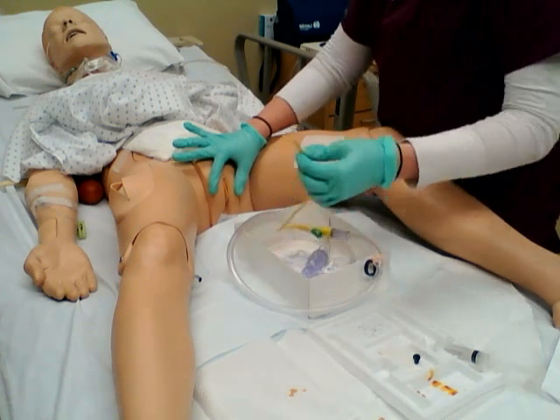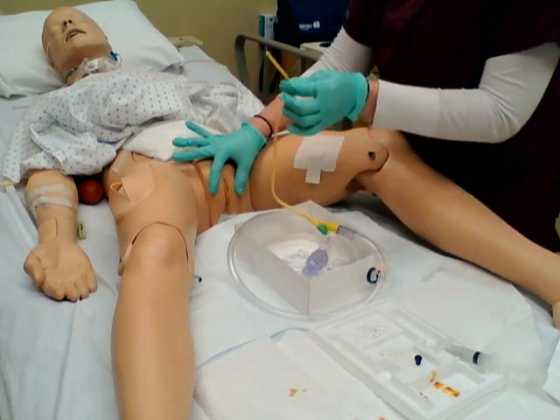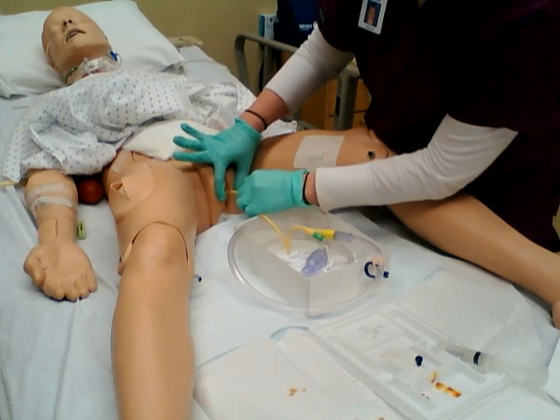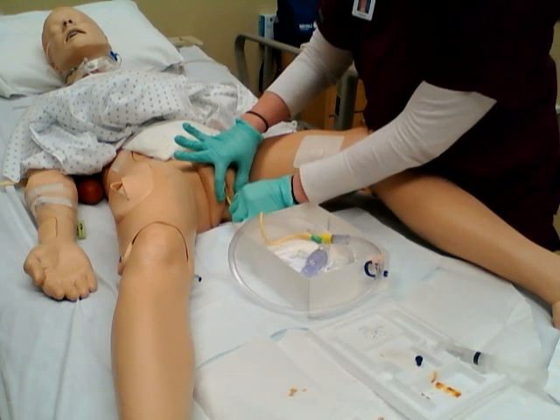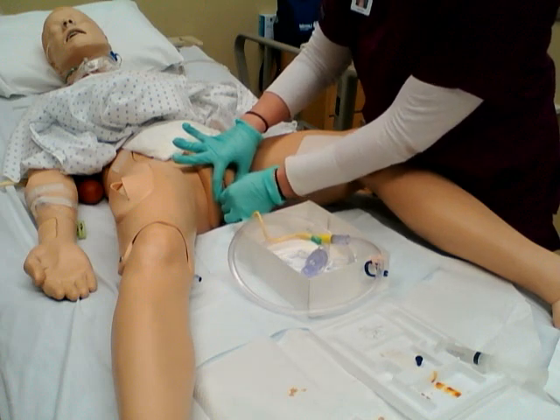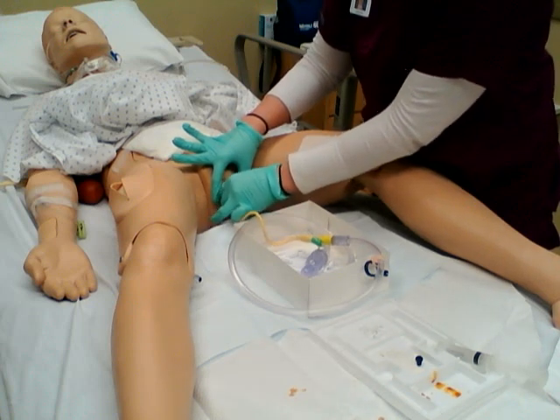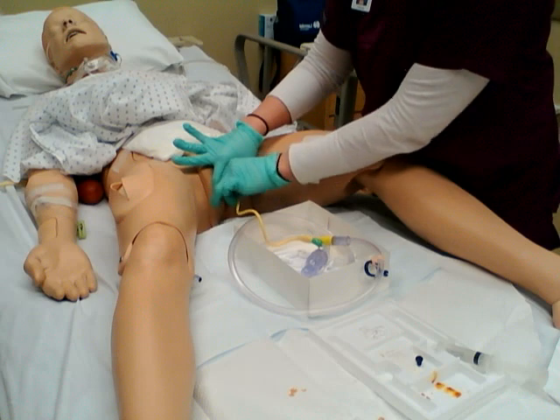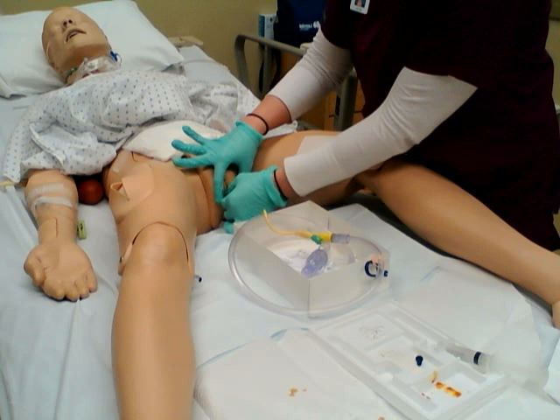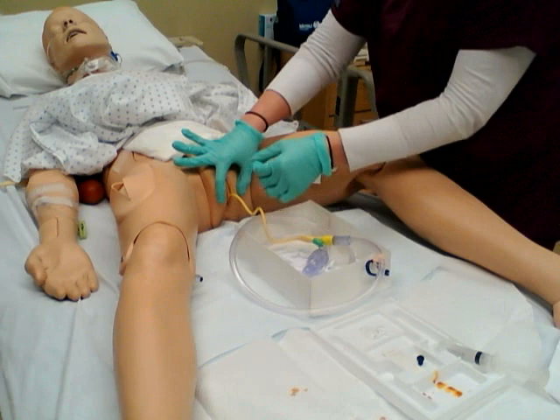you're going to grab the tip of the catheter about 3 inches up, put it into the lubricant, which I'm not actually going to do for the sake of the video validation. I'm going to go about 3 to 4 inches up until I see urine return. Now that I'm seeing urine return, I would go up 1 more inch. And a good way to measure that is just put your hand an inch down and then insert up to the finger point.